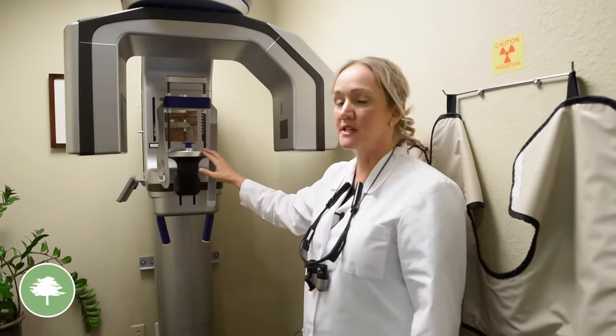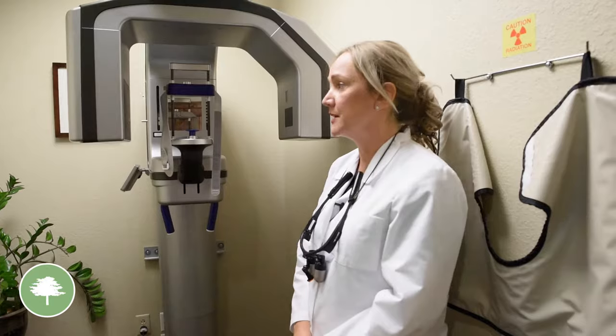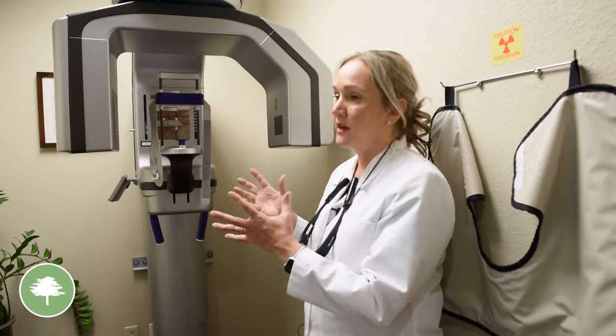It captures the neck area, giving us a more comprehensive look at all of the face, head, and neck area. We can also assess your airway to see if you have any restrictions. It's a pretty quick machine — it doesn't take very long at all and it's pain free.